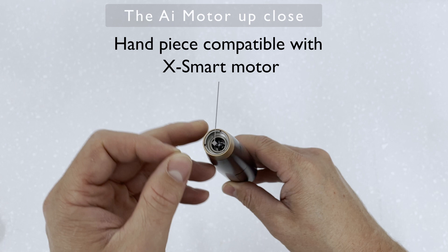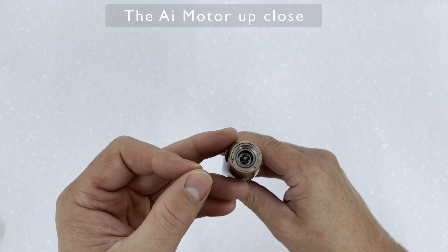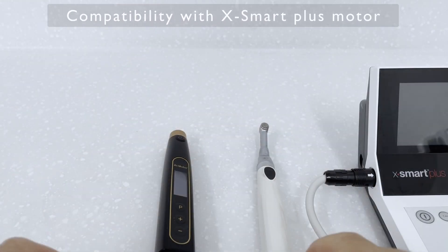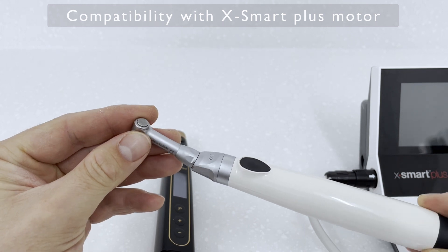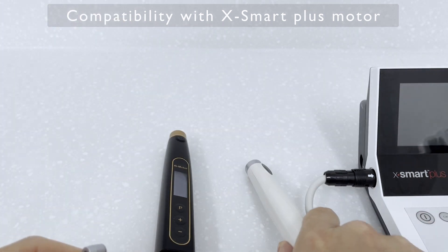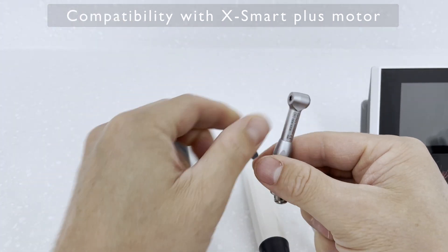Another cool feature of this motor is that the handpiece ends are compatible with the X-Smart motor. So if you already have an X-Smart motor, you can use your old handpiece heads — although I'm not too sure if that invalidates the warranty.